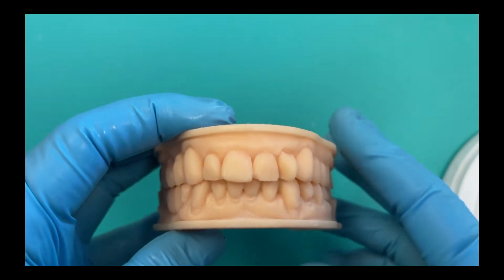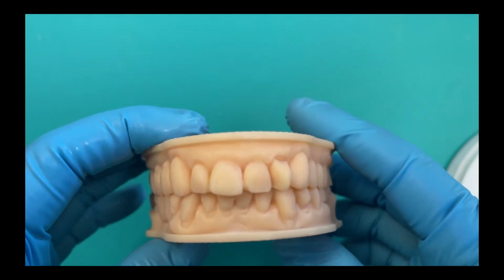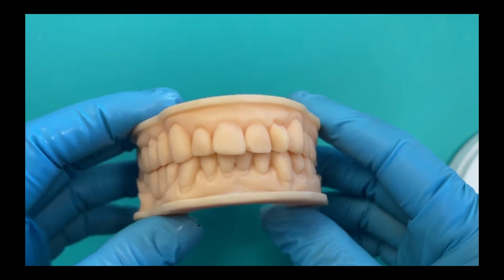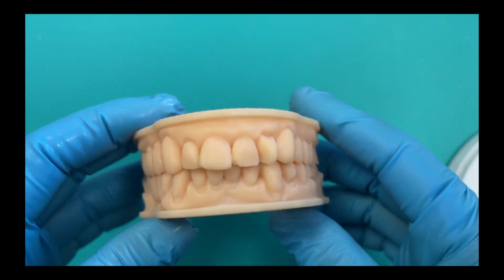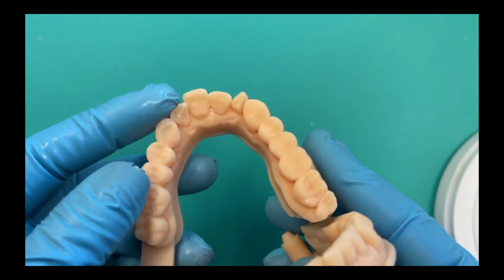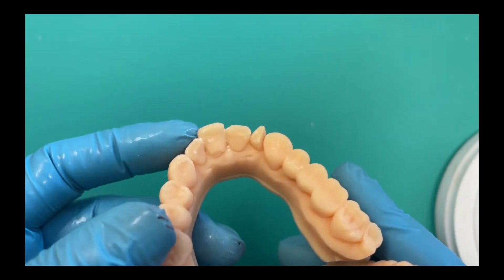And while this case is not a 3-day crown because it's an anterior case, it's a very interesting case we're going to take a look at nonetheless. Tooth number 7 is a natural tooth. Tooth number 8 for the patient, and the doctor wants us to treat teeth 7 through 10.